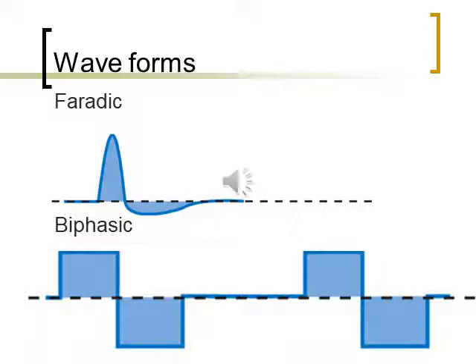On the bottom, we have what we would call a basic biphasic. This is actually what your pure TENS looks like. We have a biphasic current, we have two phases, and it's pulsed because you don't have a continuous waveform there. Again, when we talk about pure TENS, or what I also call many times a basic biphasic, that's what that waveform actually looks like.